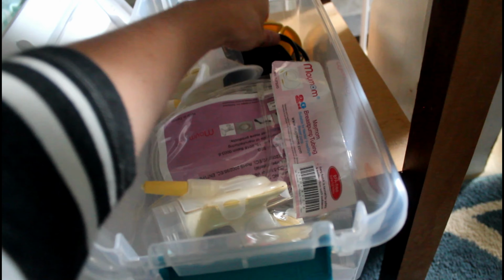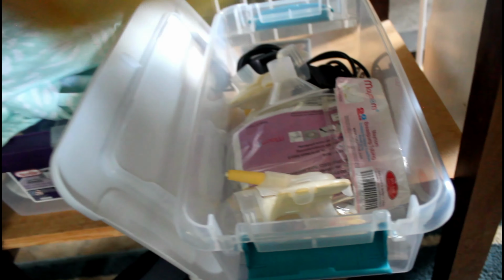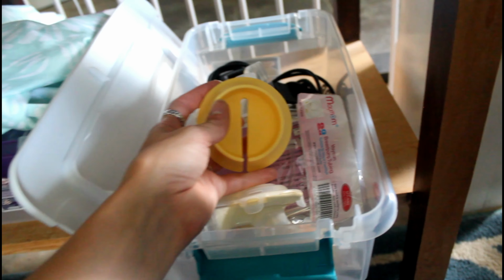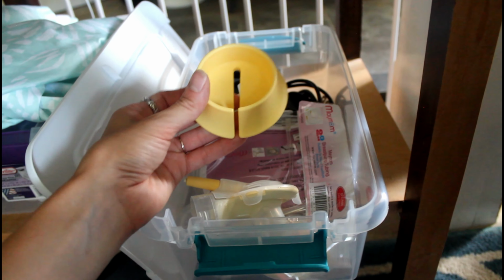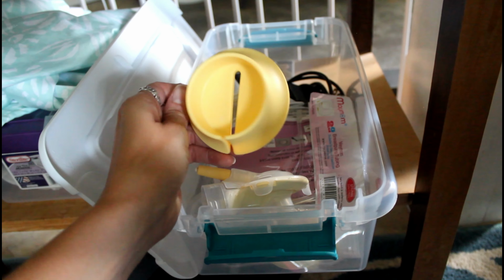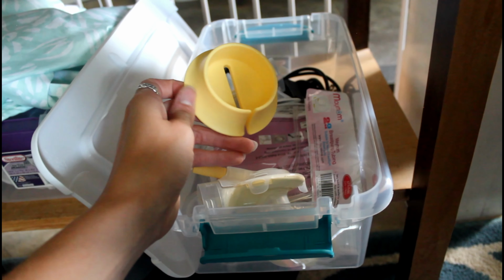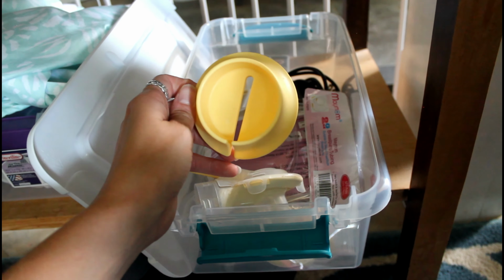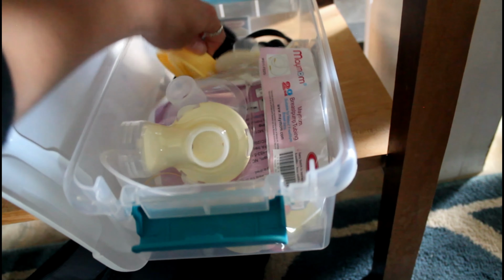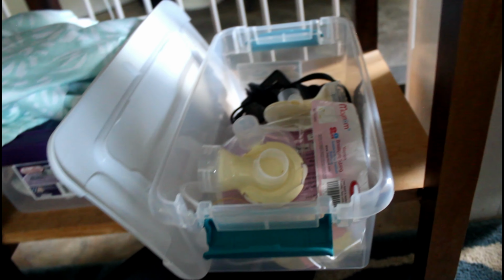There's another flange. Oh, I was looking for these. Oh my god, I'm going to put these up here. So if you're wondering what these are, this is a bottle stand so that when you're done pumping, and I do this all the time, my husband can totally account for it, you put your bottles down, and because they're top heavy, they just fall over and the milk spills everywhere. This prevents that because you just shove the milk bottle right into it. Let me see if I can find the other one. Oh, here it is. Yep, put those up there.